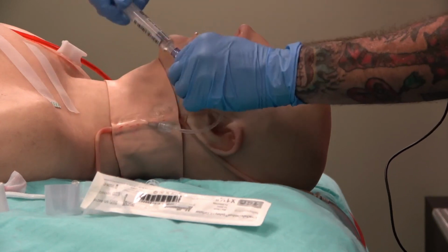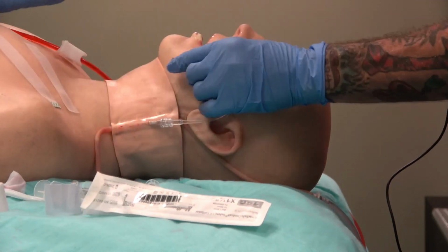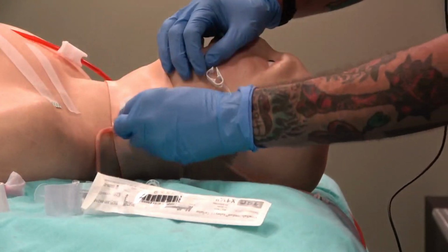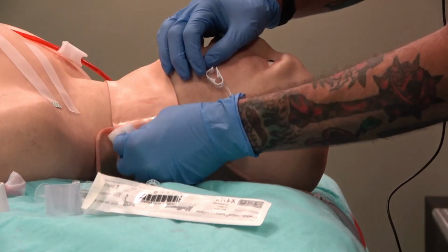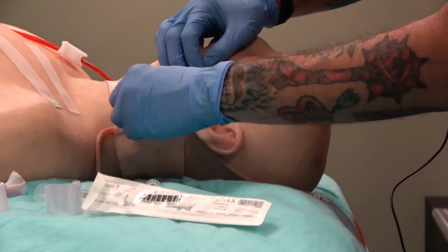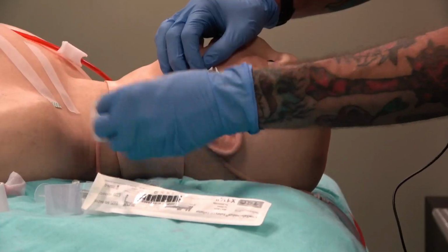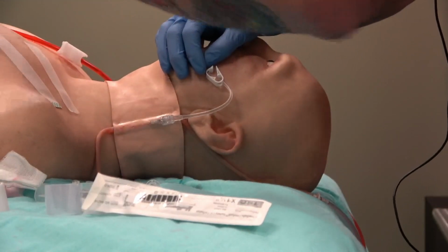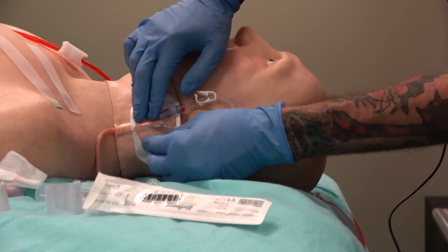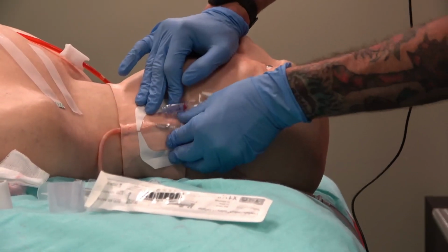Awesome. I'll take this off. And realistically, this is kind of wet, whether it be diaphoresis, blood, whatever. And I want this to stay in place. And Tegaderms, tape, they don't like moist skin.